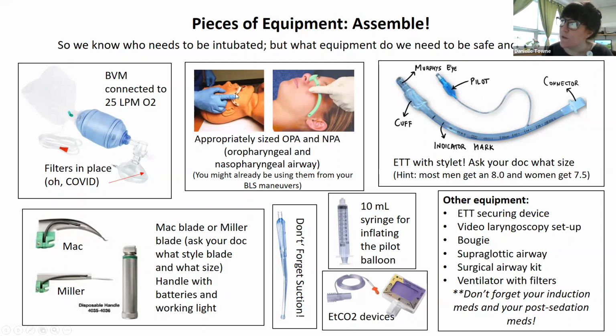And so we don't use this on somebody that has a gag reflex. We measure it from the corner of the mouth to the corner of the ear, and that's how you get an appropriate size. If you don't measure it and you put one in that's too big or too small, it's actually going to cause a worsening problem with your tongue and some of the structure displacement, and it can actually make it harder to ventilate. So make sure that you always measure it.